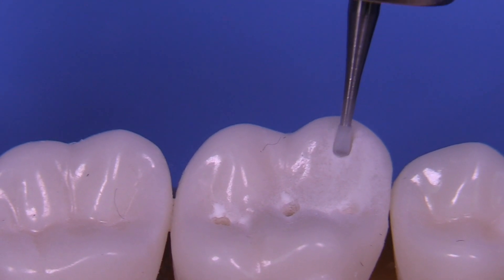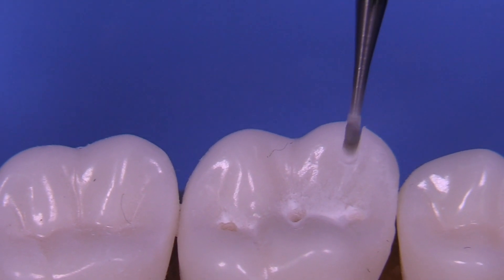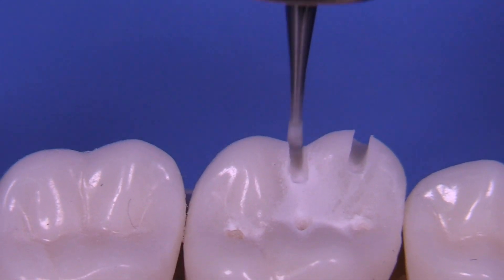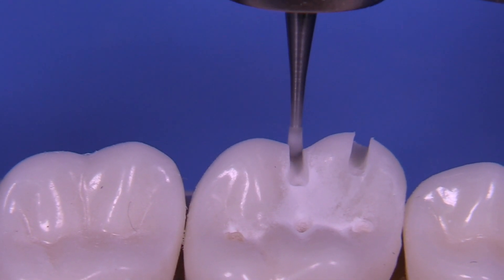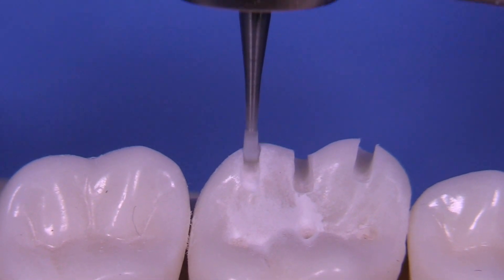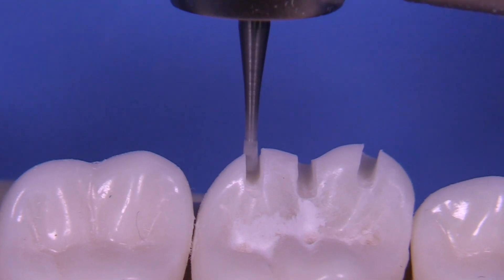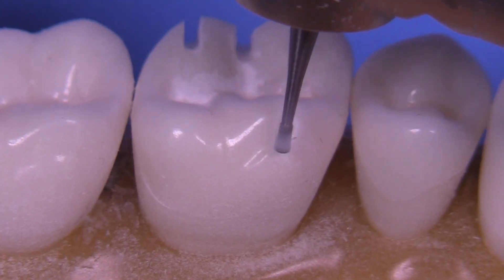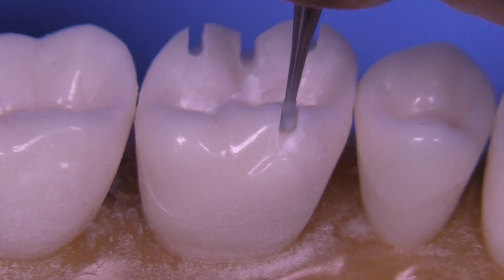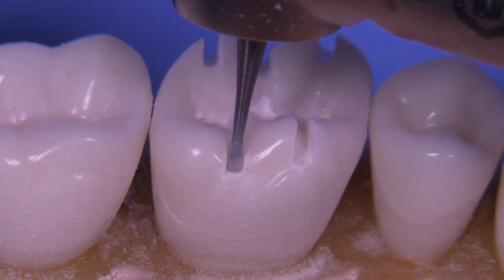You can experiment with different ways of making these depth cuts. Right now I'm showing you three in the center, and then I'm also going to make a few on the non-functional cusps and then some on the functional cusp on the lingual side. All of them are being made at approximately 1.5 millimeters in depth, and this will serve very nicely for you to reduce the preparation occlusally. It's really common to under-reduce PFMs.